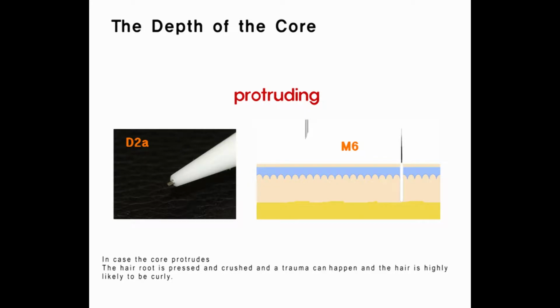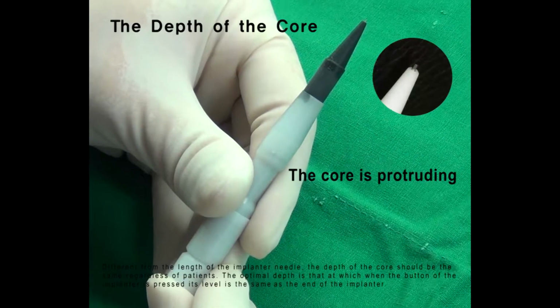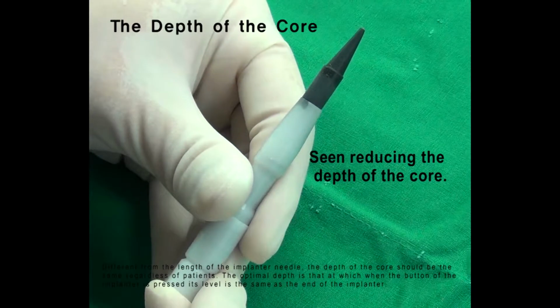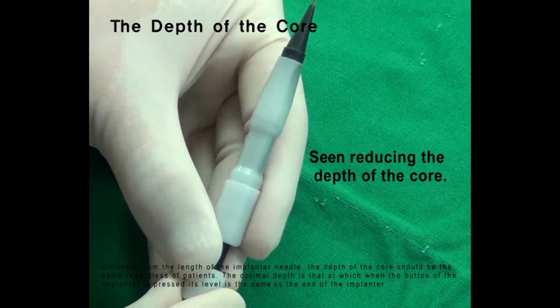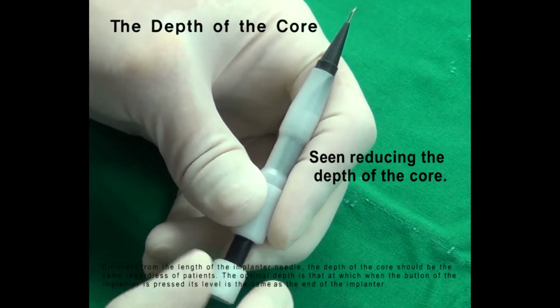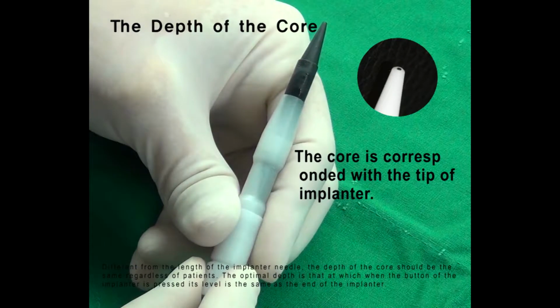In case the core protrudes, the hair root is pressed and crushed and a trauma can happen, and the hair is highly likely to be curly. Different from the length of the implanter needle, the depth of the core should be the same regardless of patients. The optimal depth is that at which, when the button of the implanter is pressed, its level is the same as the end of the implanter.